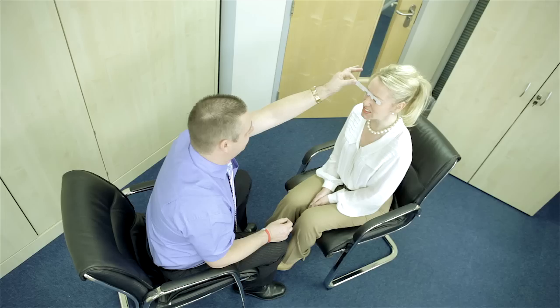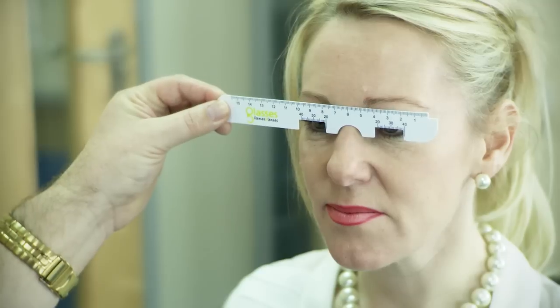Your helper should hold the PD ruler between their thumb and forefinger, resting the ruler on the bridge of your nose. The person taking the measurement should close their right eye and look directly opposite into your right eye. Make sure you look directly into their open eye as you are being measured. Make a mental note of the measurement from the bridge of the nose to the center of the pupil in millimeters.